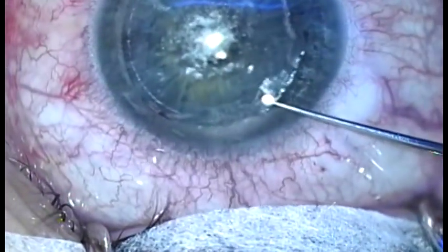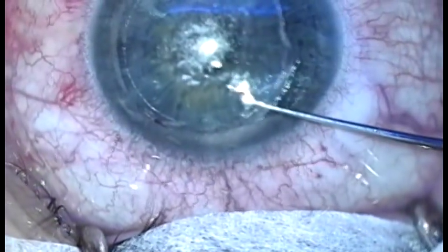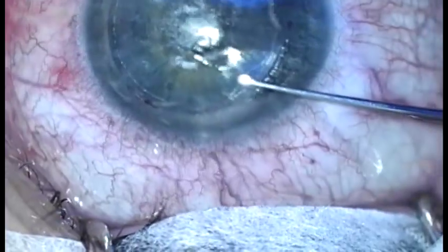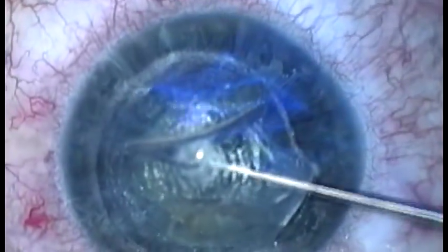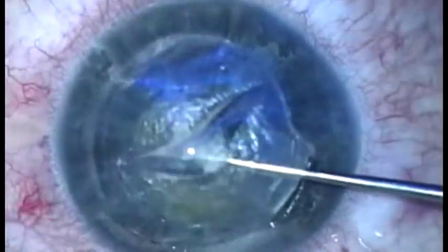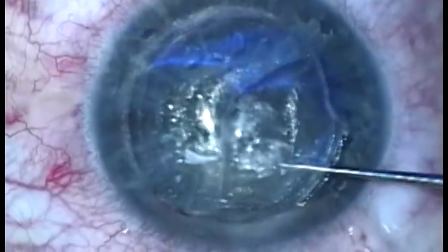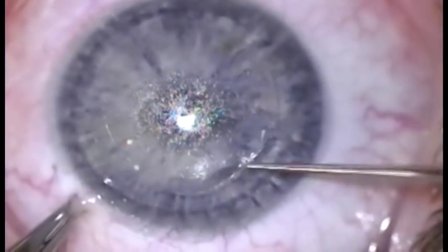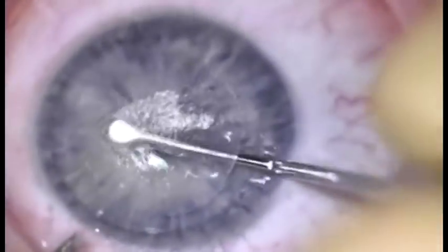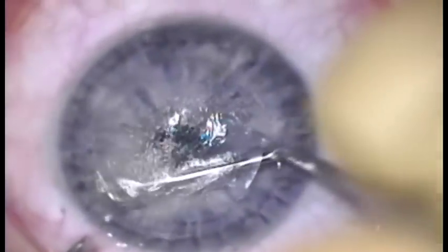If the lower interface is dissected first, the separation of the lenticule from the cap may be tough but it is straightforwardly accomplished by an inverted Sinskey hook that pulls the edge of the lenticule separating it from the cap. An upward maneuver with the hook may be used to fold the lenticule, opening space to allow the spatula to enter the upper interface to complete the separation.